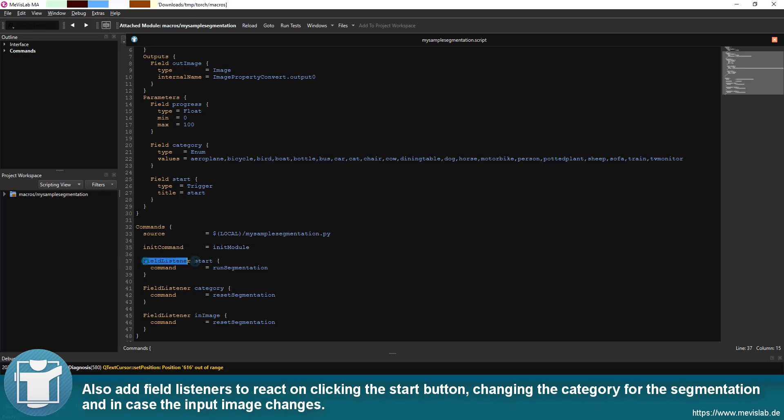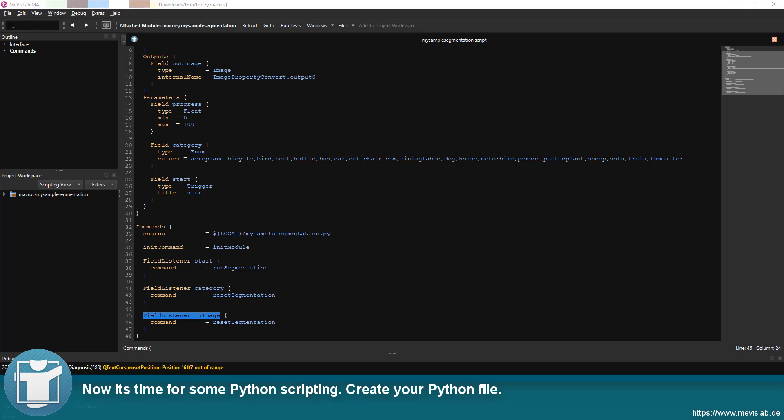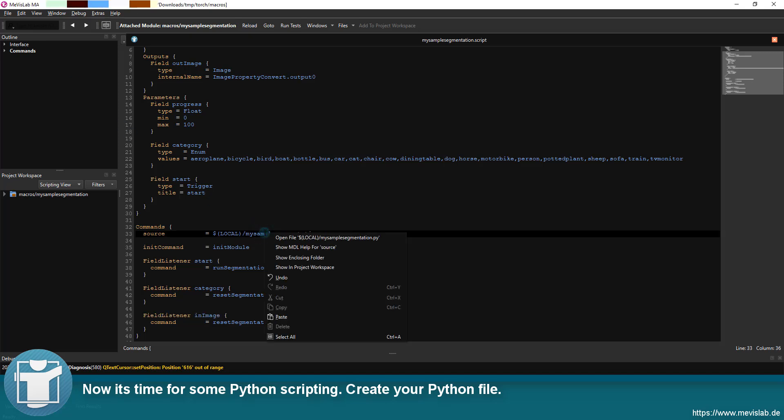Also add field listeners to react on clicking the start button, changing the category for the segmentation and in case the input image changes. Now it's time for some Python scripting.